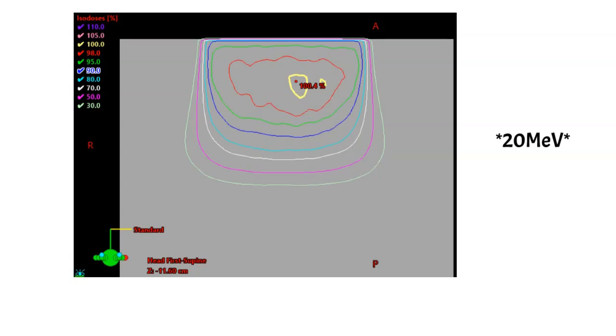On the contrary, if you look towards the lower isodose lines, like the 30 and 50, those actually tend to balloon outward. So we get this weird behavior of the high and low isodose lines, with the higher isodose lines tending to constrict in, and the lower ones tending to balloon outward.